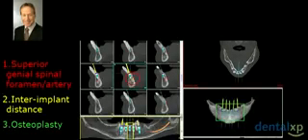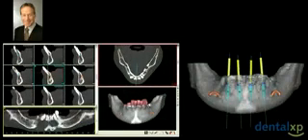Well, there are inter-implant distance issues, and we're going to have to do precision osteoplasty. This view here is indicating the crestal relationship and how the implants are going to be placed below the crest of the bone. You saw the same exact thing that Scott showed you. So this is showing you now the position of the implants. And we elected to have the guide designed to fit on the native bone and reduce the bone later.